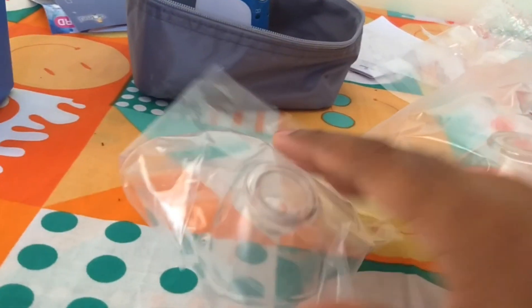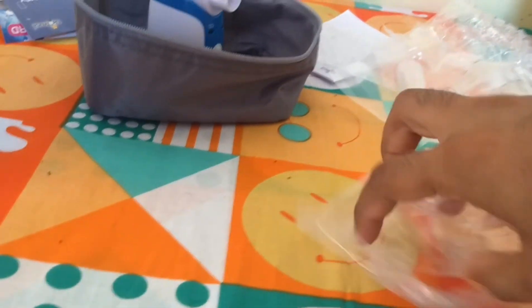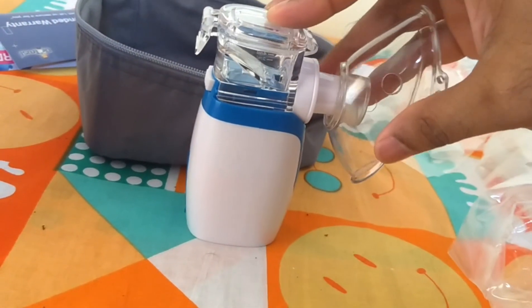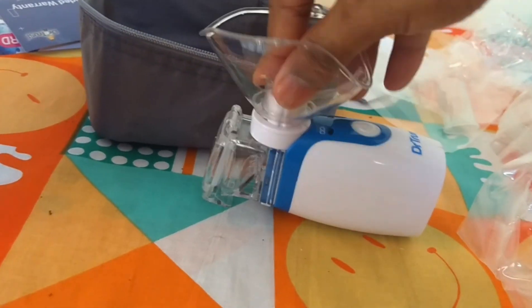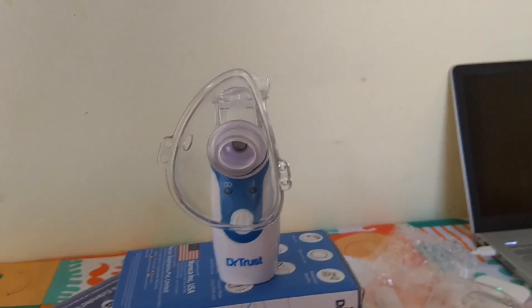We have two masks — one for adults and one for kids. Let me connect one of them.